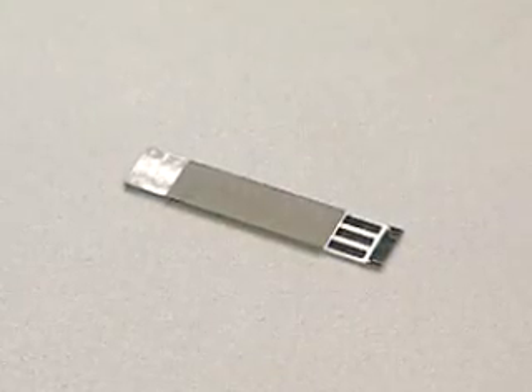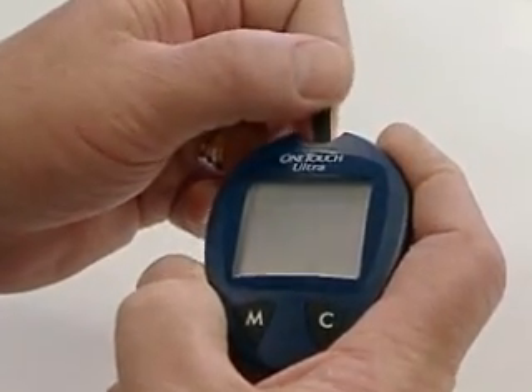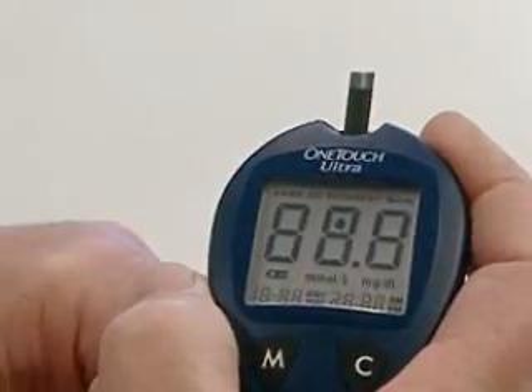Always use a whole test strip and insert it into the meter until you feel it stop against the end of the meter guide.